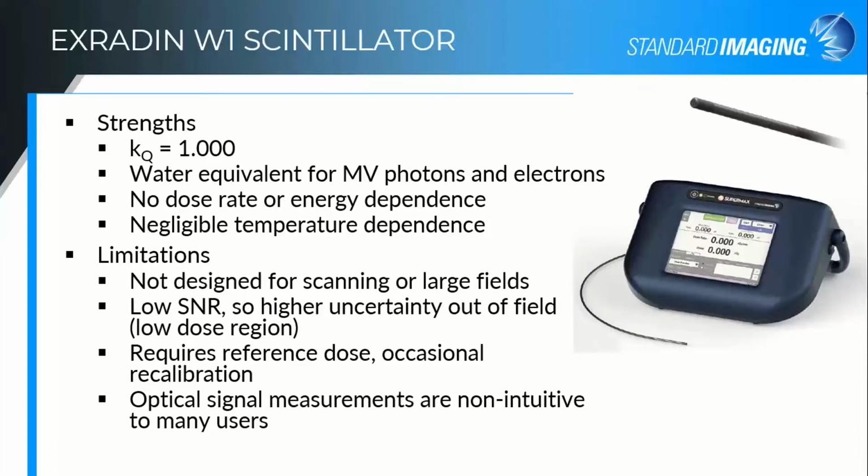If at some point we start doing on patient surface sort of measurements, which we are not FDA cleared for right now, but if we go down that road in the future, then there may be some temperature corrections that would need to be considered.